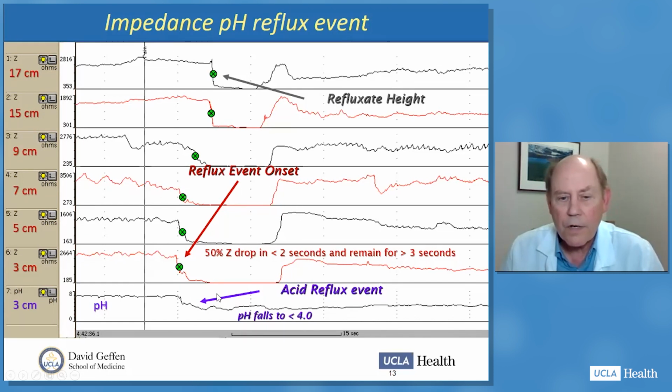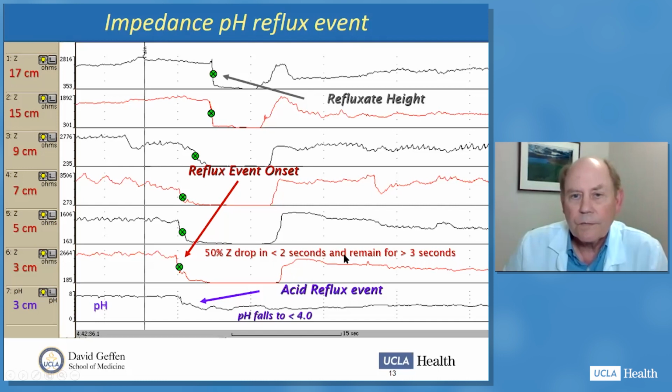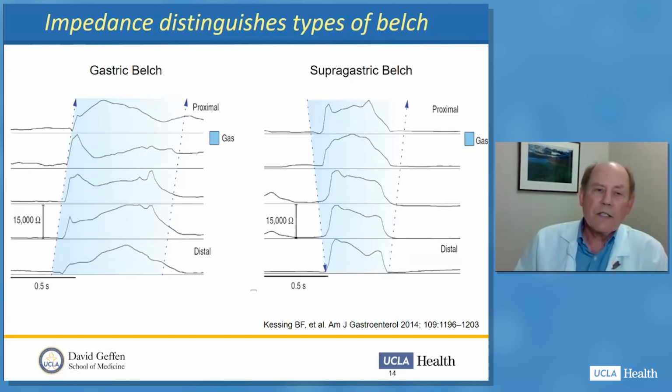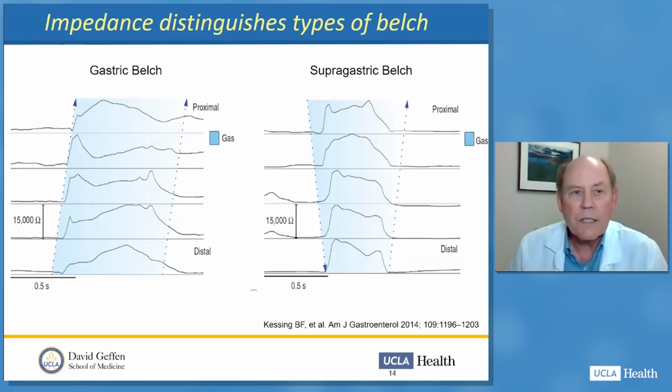And this is what we look for when we're looking for reflux in the esophagus. Sometimes there is not an associated drop in pH. So that would be either a non-acid reflux event or a weakly acid reflux event. Now, recently, there's been a lot of interest in using the impedance method to identify other boluses in the esophagus. The most recent is the belch.